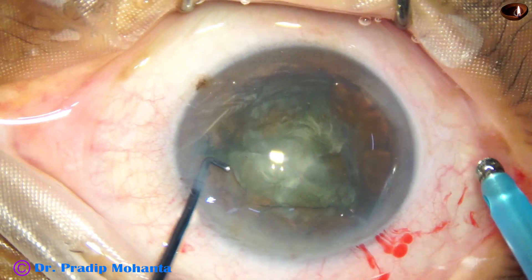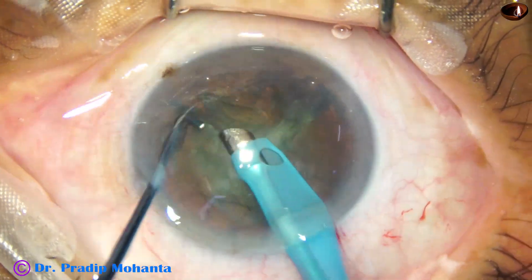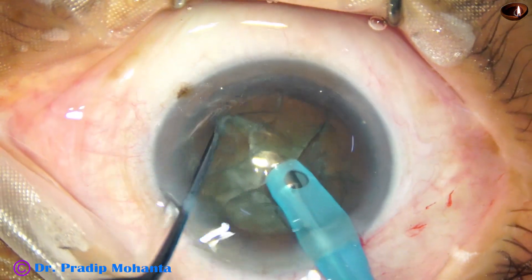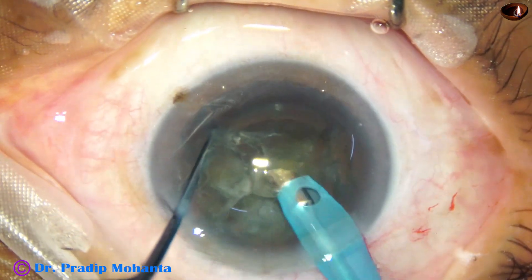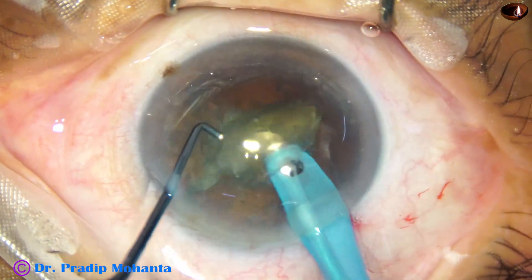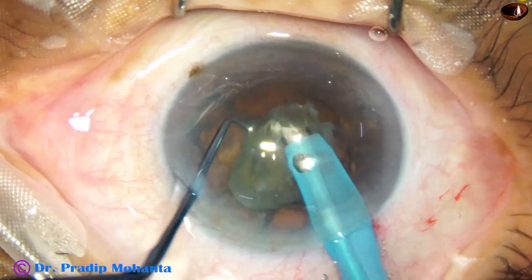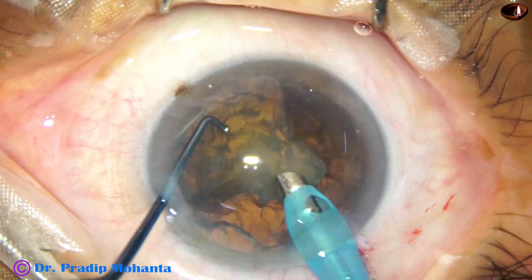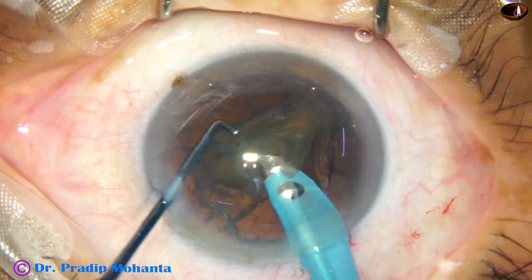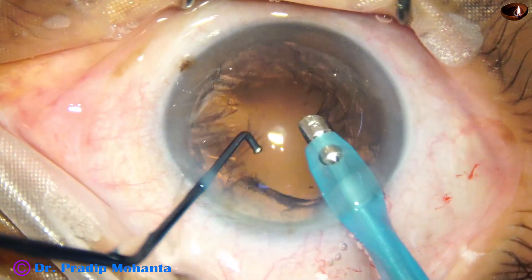Now here goes the phaco needle — some superficial cortical lens matter is removed, the nucleus is rotated a few times, and now here we can easily embrace the hemi-nucleus by the nucleus sustainer and break it into pieces. This is the other piece, and this is the final piece. At this time the vacuum is reduced a bit — initially the vacuum was 480 mmHg and now it is 400. Ultrasonic energy is set at 60%.